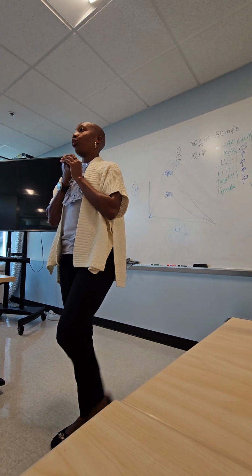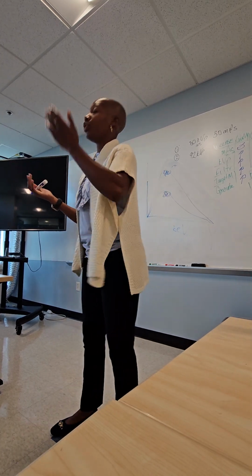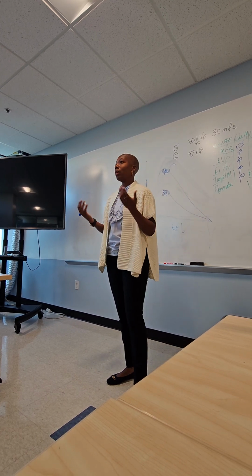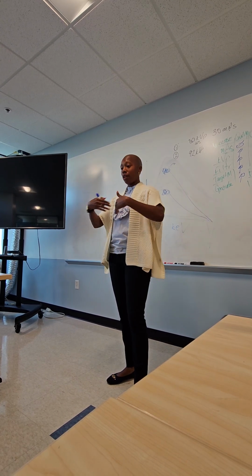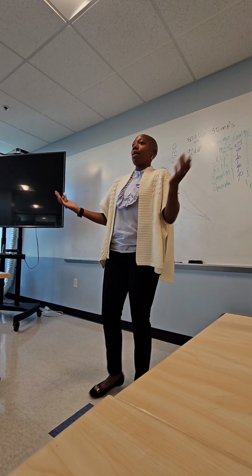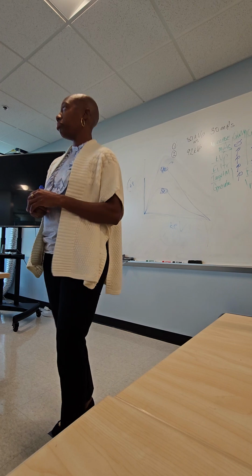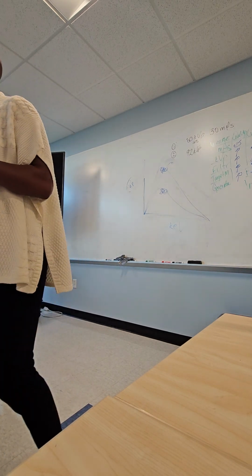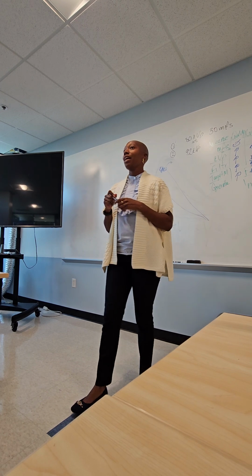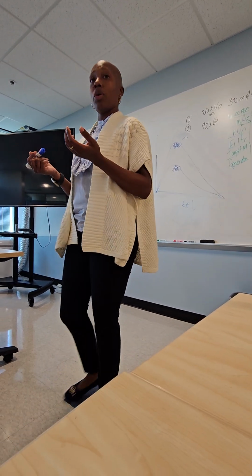You should know, why is patient positioning important when you're using that? Why does it matter? If there's an ionization chamber at the bottom that's going to just pick up an amount of radiation, what does it matter where I put the patient? It shouldn't, right? That's wrong. It does matter. It really matters, because it depends on what the exam is you're doing.